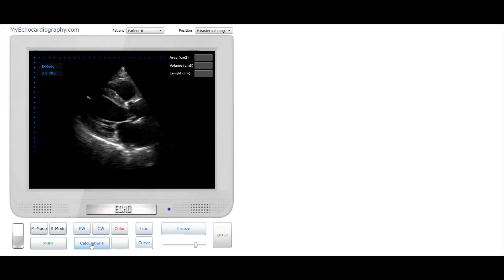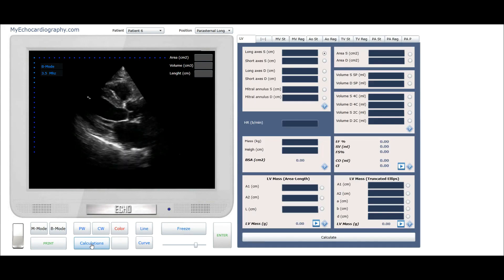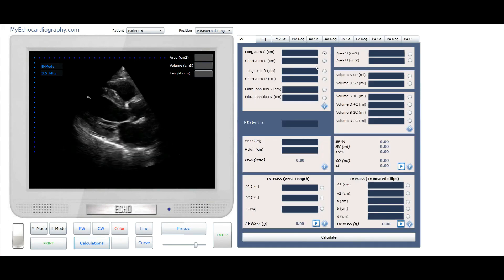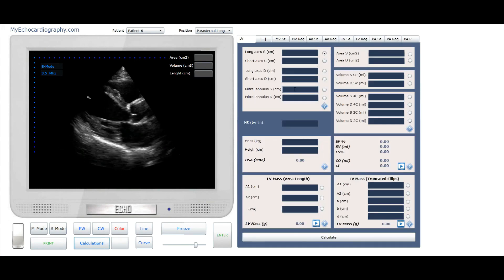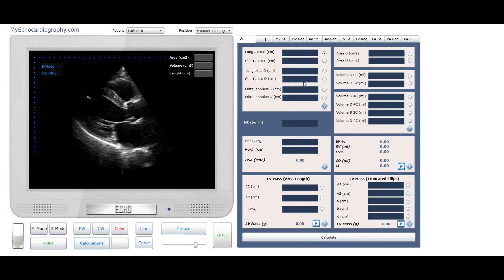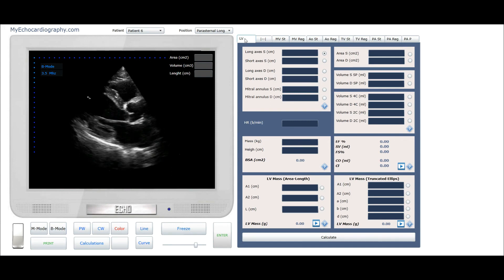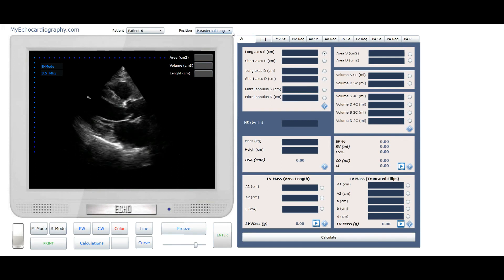Click the button Calculations and select the tab Left Ventricle. In the tab, select the name of measurement. From the list, select Apical 4 Chamber View.